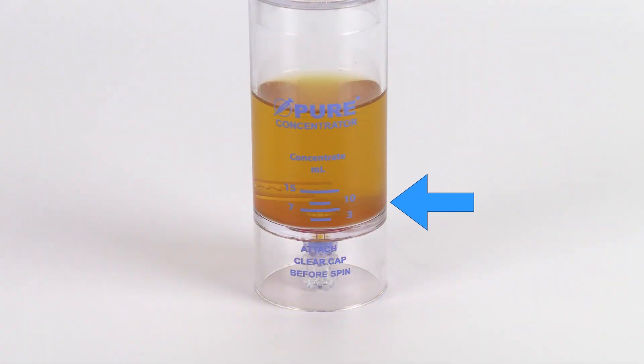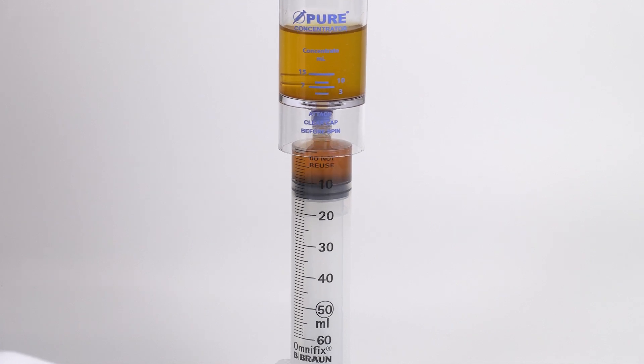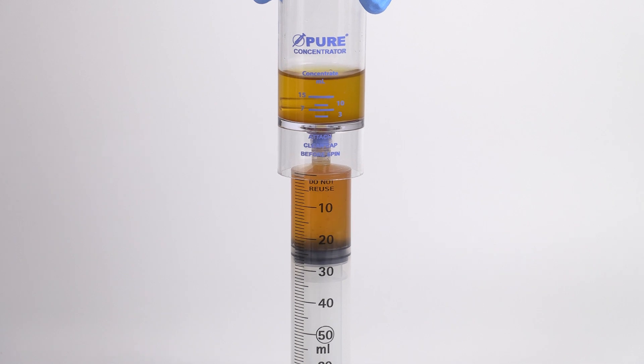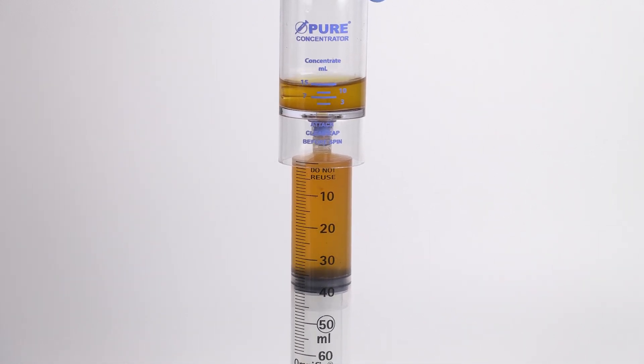After centrifugation, the platelet buffy coat layer will be clearly visible at the bottom of the concentrator device. Attach a sterile syringe to the needleless port of the device and aspirate the platelet-poor plasma, leaving approximately 14 milliliters, or the desired amount, in the device.